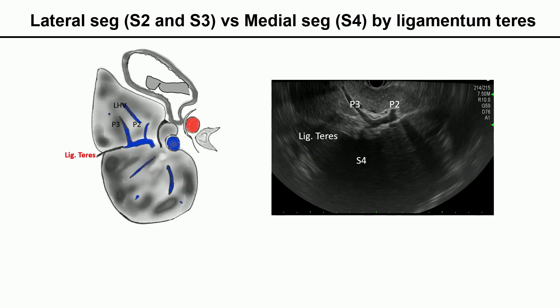With more clockwise rotation, P2 and P3 can be seen making the umbilical portion of the left portal vein, slightly pushing the probe inward along the liver surface. The hyperechoic line seen arising from the umbilical portion of the left portal vein is the ligamentum teres — the obliterated left umbilical vein — which separates S2 and S3 from S4.